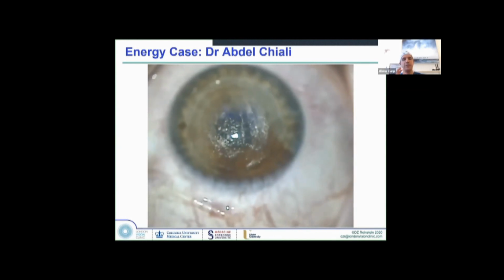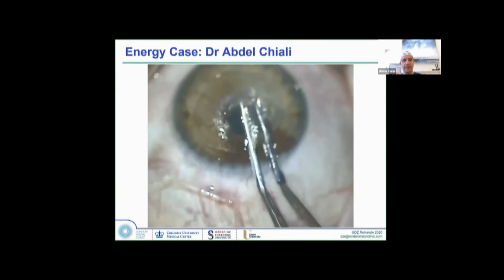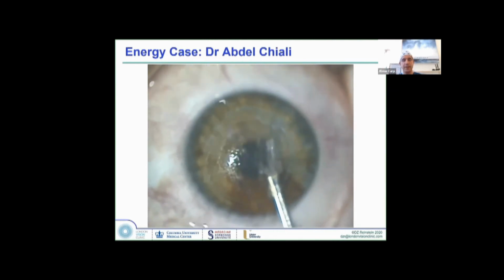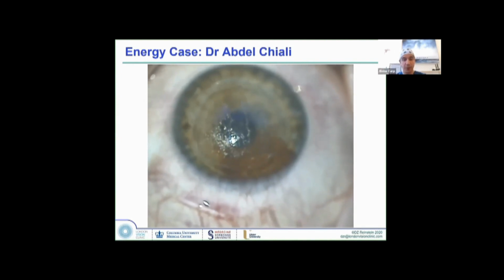But again, this was just a very, very super lucky outcome that the patient had a really good result, because ultimately the risk of slithers by creating two lenticles at the same depth was quite high. One should never do that because of that risk. And that's almost impossible to fix, by the way. And then the second part is, if you have a dark spot, rather switch to LASIK because of the risk of creating a false plane and creating an irregular lenticle.